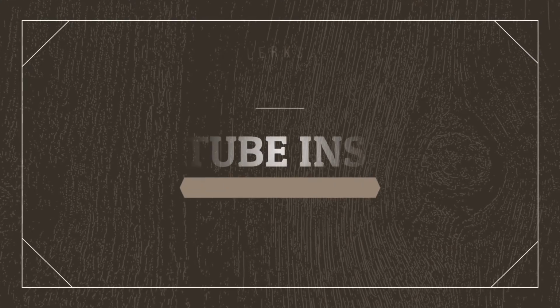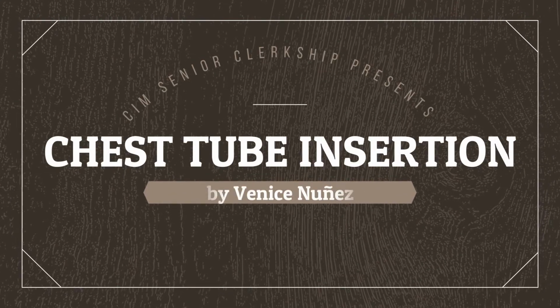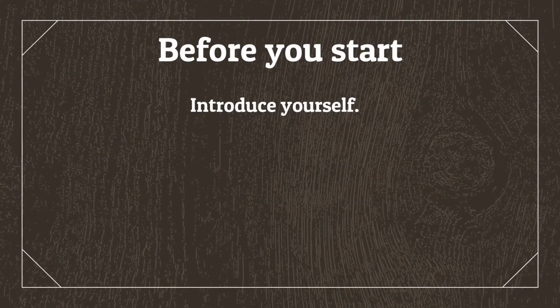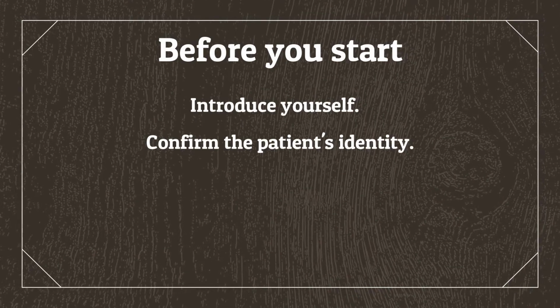Good day everyone, I am Senior Clerk Venice Nunez and I will be demonstrating how to properly insert a chest tube. Before you start, make sure to introduce yourself and confirm the identity of the patient.